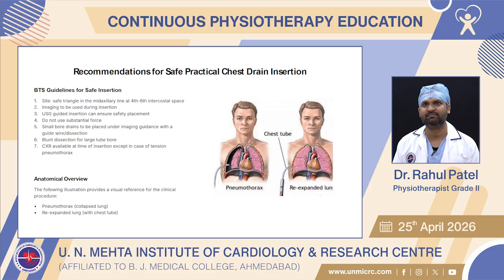Recommendations for safe practical chest drain insertion. Let's see the image. Pneumothorax and chest tube insertion after re-expanding the lung. BTS guideline for safe insertion. First, site: the safe triangle in the mid-axillary line at the 4th to 6th intercostal space. Second, imaging to be used during insertion.